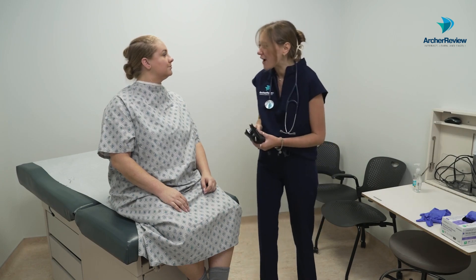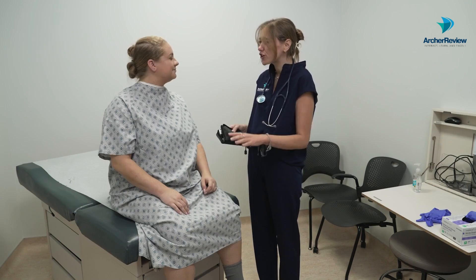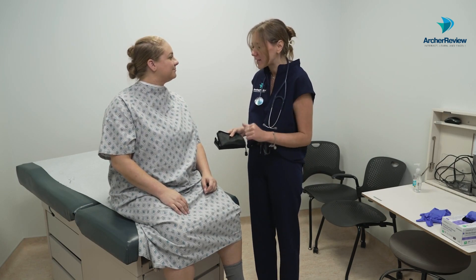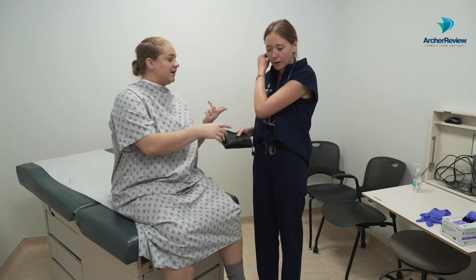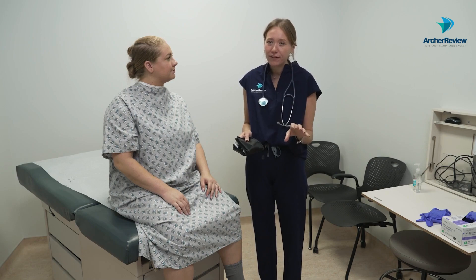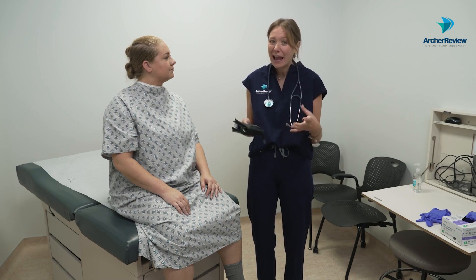Hi, I'm Dr. Caffrey. I'm going to be checking your blood sugar today. Are you good with checking blood sugars? Do you have a fear of needles or blood? Is there a finger preference that you have? I usually do one of my index fingers. I always like to ask my clients what their finger preference is, especially because they're often getting these blood sugar checks multiple times a day, and they may have a preference.